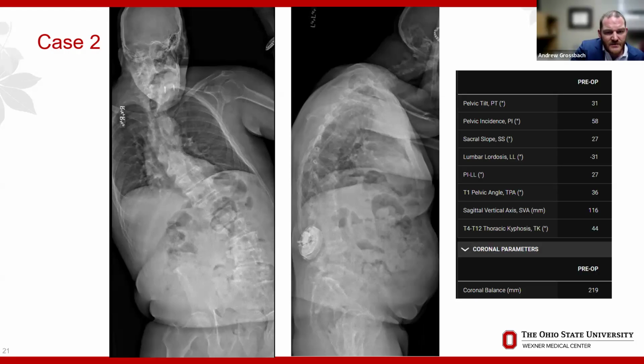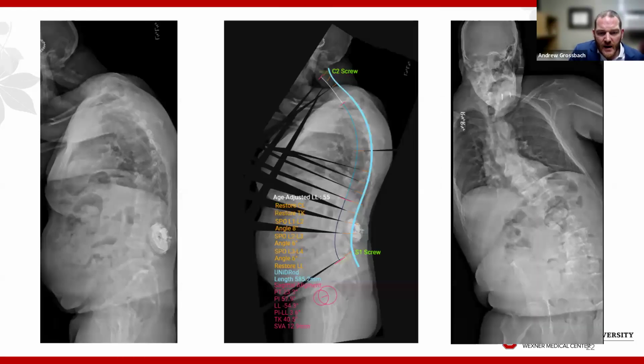But sometimes when you're starting from something that's going to be a big surgery, some planning software can be very helpful, because they can give you different looks and say, you know what, this is what it's going to look like, and you can have them give you different options. And so in the middle here is a plan that we ultimately went with, just relying on posterior column osteotomies. And looking at them sagittally might not be perfect after this, but sometimes you'd rather undercorrect than overcorrect.